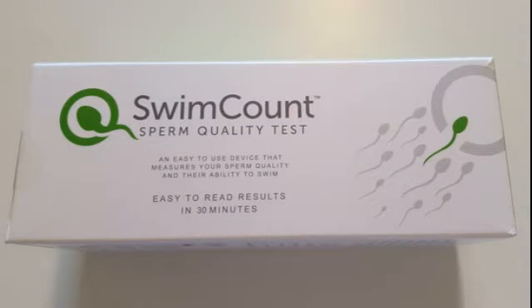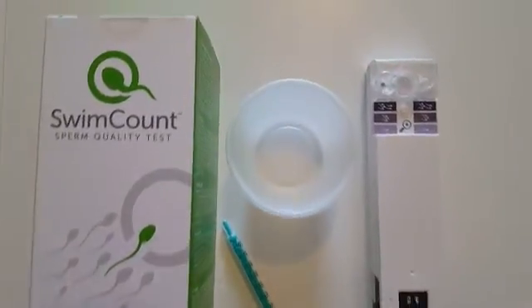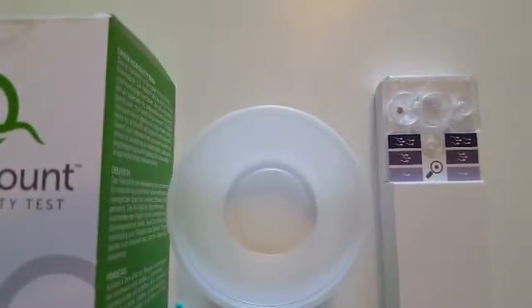Inside the box you'll find detailed instructions on how to carry out the test, a sample cup, a syringe, and the test device.